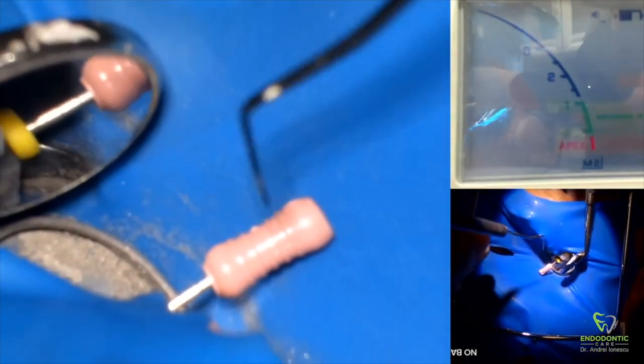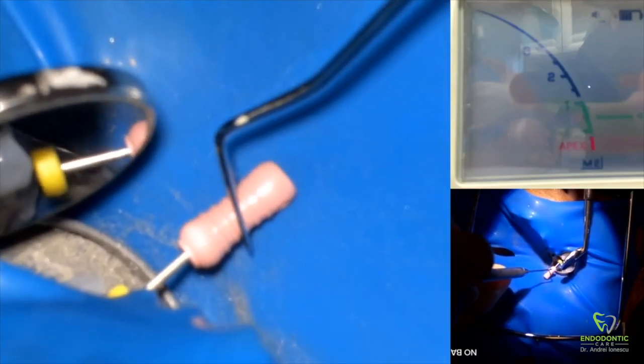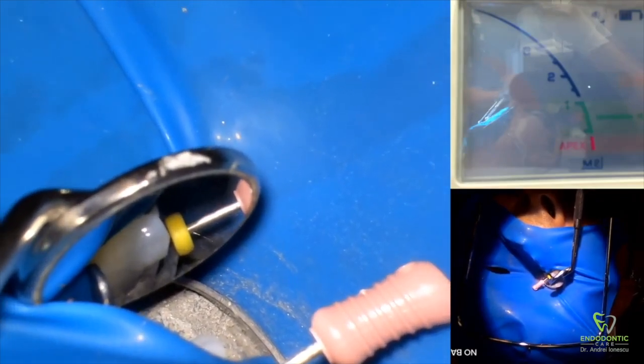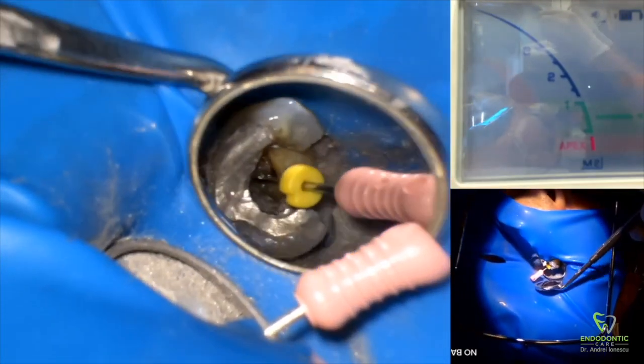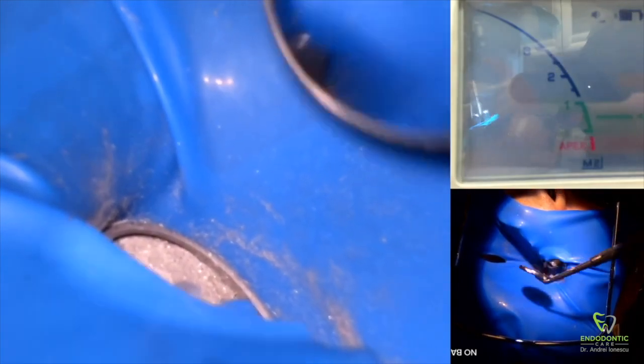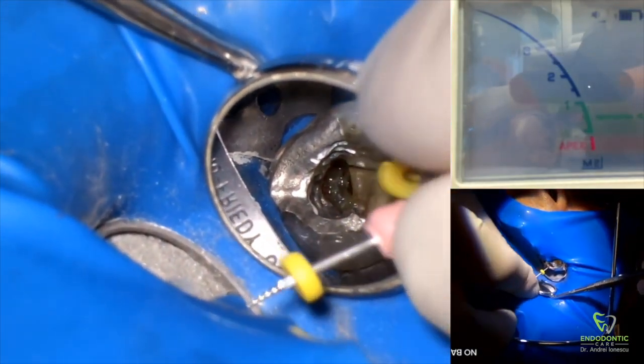We're going to keep using small files — a 6, then working up to an 8, and then a 10. Be very careful not to advance too quickly; don't advance to the next file until the previous file is very loose in the canal. You want the 6 file to basically fall in all the way to the apex before moving on to the 8, and same with the 8 to the 10. Once you have a smooth glide path with a 10k file, you can start using rotaries — something like a ProGlider or PathFiles are very helpful in this case.